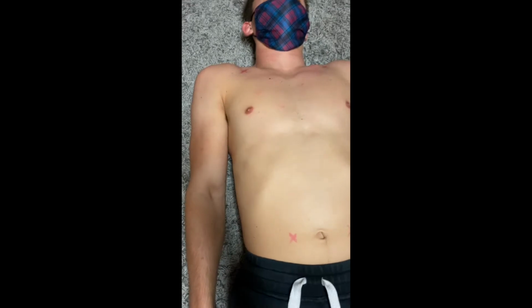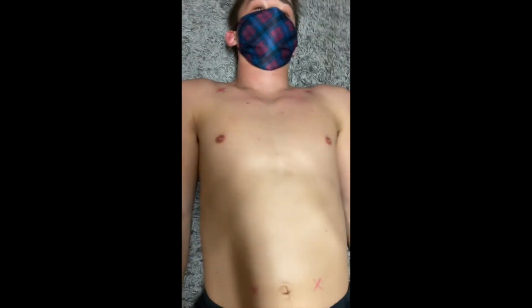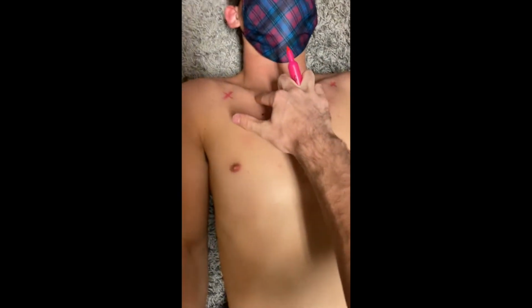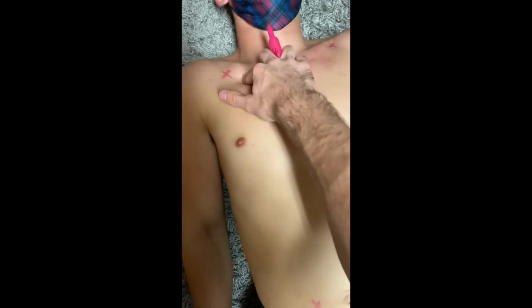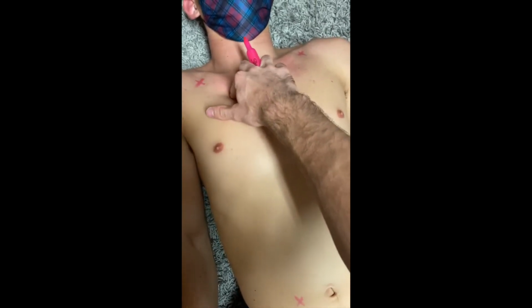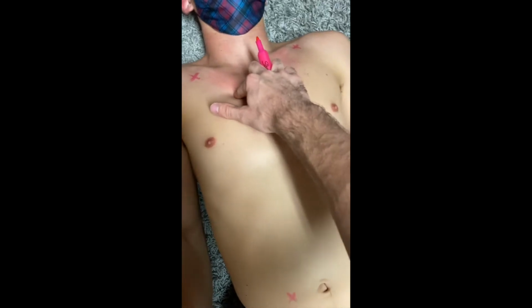So first with V1, we start at the 4th intercostal space on the right sternal border. So we come here, we're on the right side of the sternum. As in the video, you can see we've come down and try and find our first intercostal space. So come down from here. On the side of the sternum, there you go. I can feel the first one right there.